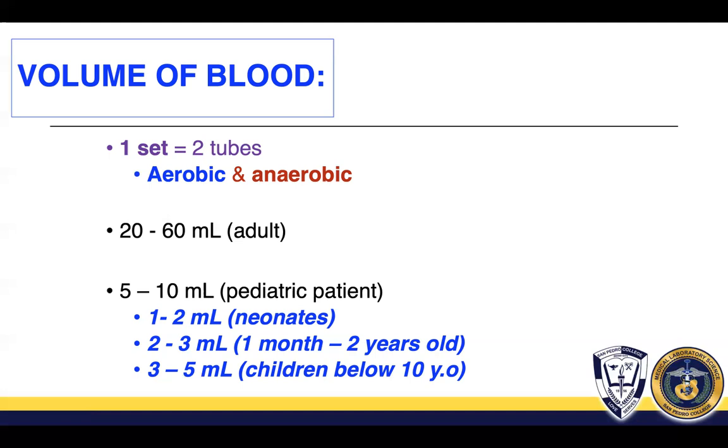Note, a single blood culture per day is not recommended. You need at least more than one bottle, at least more than 10 ml. So you need at least one set, 20 ml.